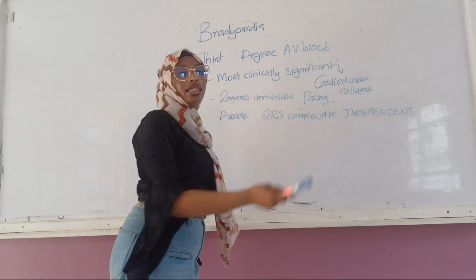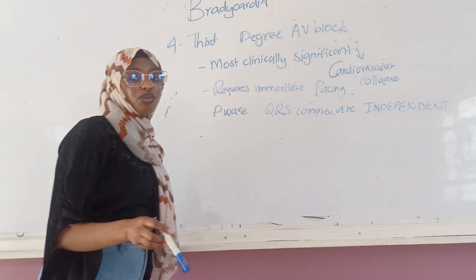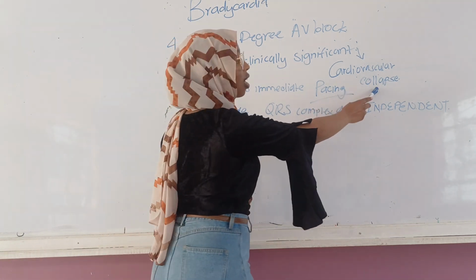And lastly, the third degree AV block. This is the most clinically significant because it can lead to cardiovascular collapse.